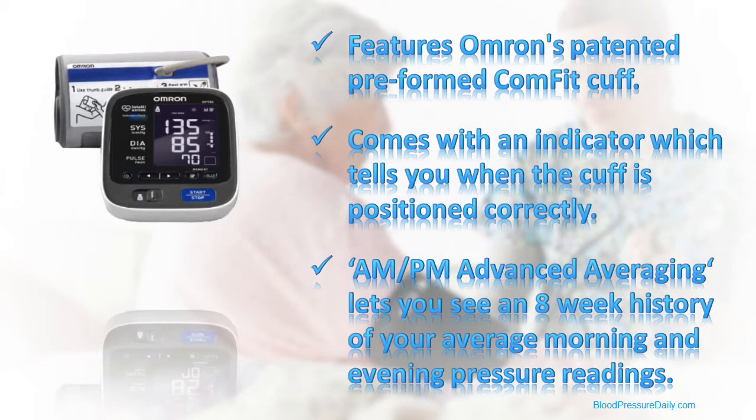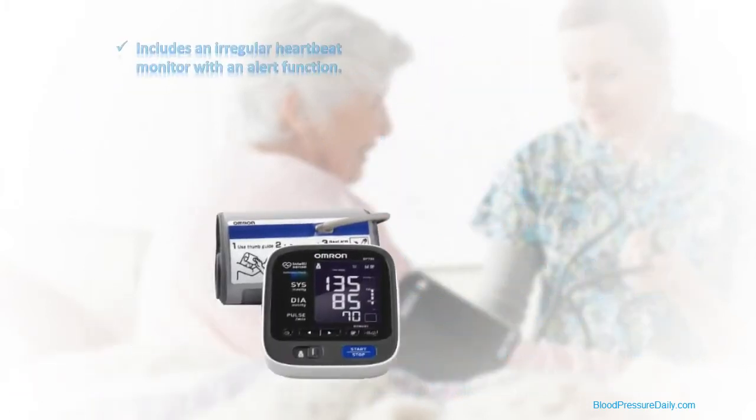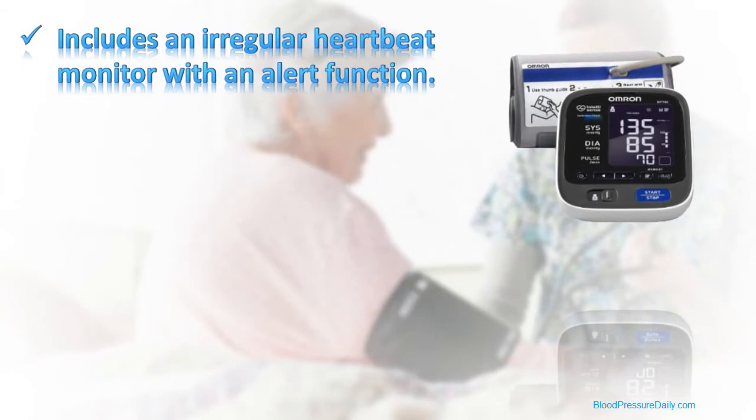While your pressure reading is being taken, the unit also keeps an eye out for irregular heartbeats, and an indicator icon will tell you if irregularities are detected.